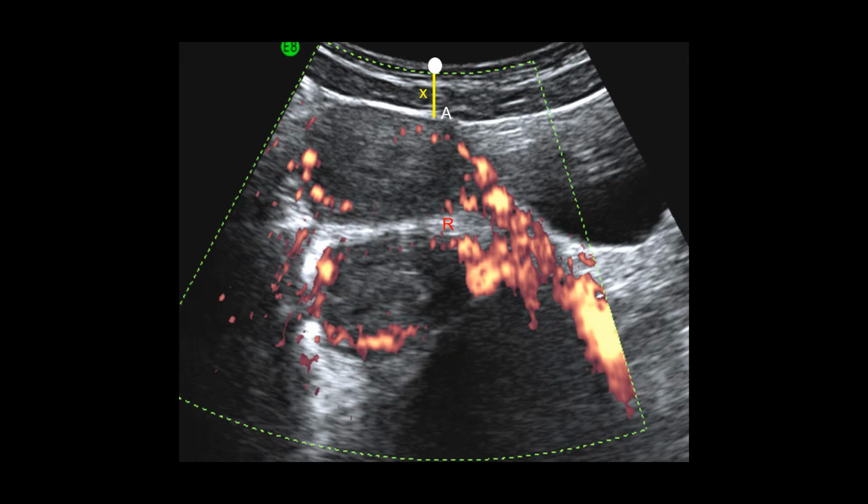It is the time spent by the ultrasound waves to cover the distance of 2x, and as the velocity of ultrasound in tissue is known, the distance x can be calculated, and point A will be allocated on the image at a distance x.